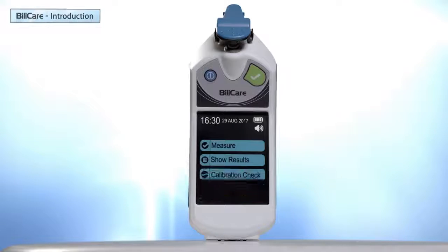Let's go through the keys of the home screen: Measure, Show Results, Calibration Check, and Setup.